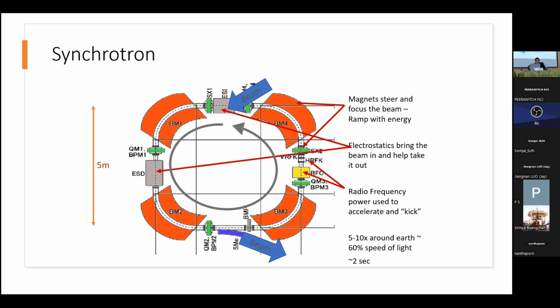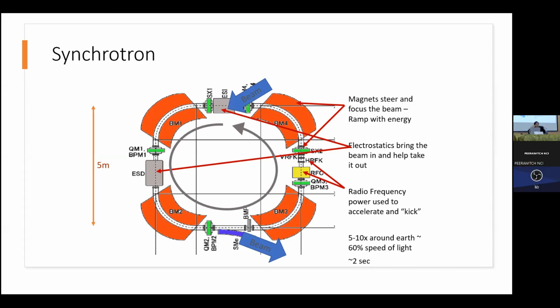The second part of the extraction, which I didn't have on this slide: older systems, particularly for proton therapy with a synchrotron base, used something called single energy extraction. You'd accelerate the particles to the energy you want to treat, which I skipped in the initial explanation. The energy is proportional to the depth in the patient, and that's the Bragg peak. That's the most important thing, and nothing goes beyond it. So when you want a particular depth to treat the patient, you choose a certain energy. Not everything is at that exact depth, so you need many, many energies to cover the tumor.